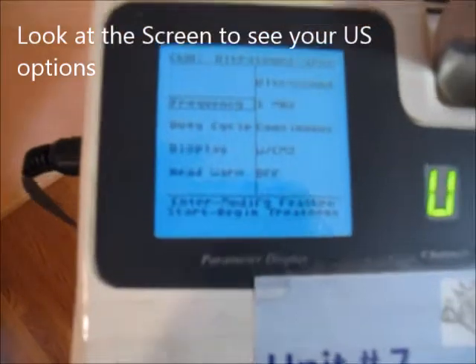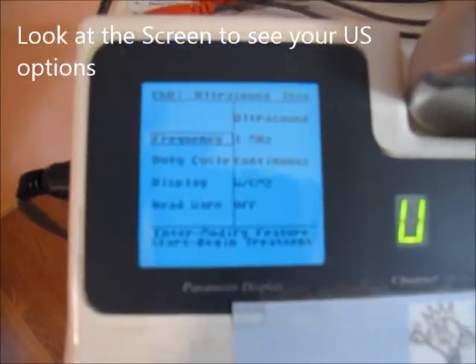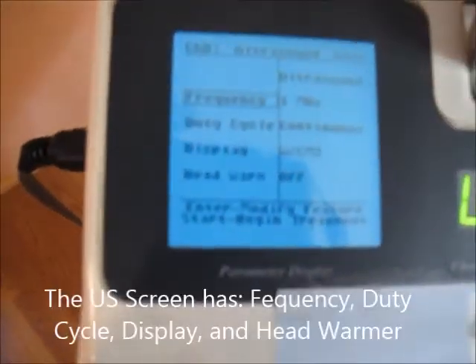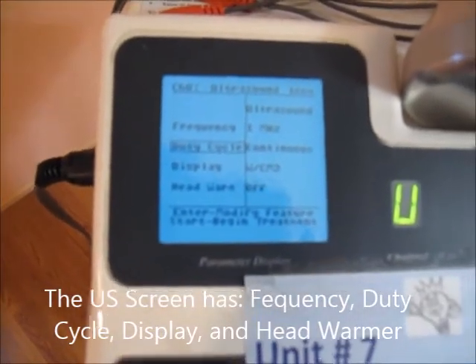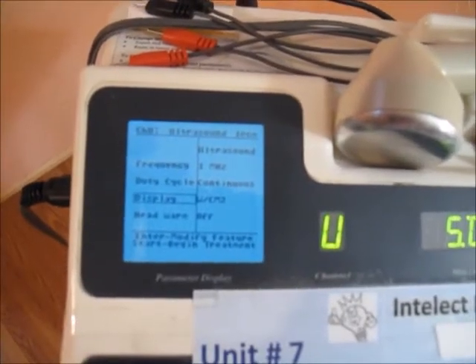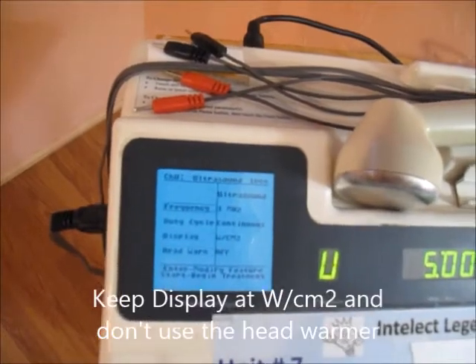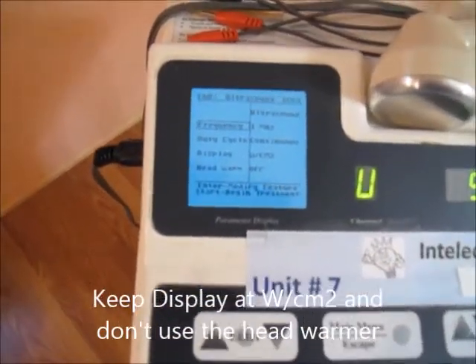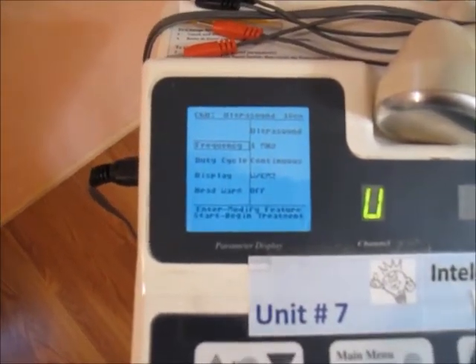Over here is a little screen asking us different questions. The questions they will ask are going to be frequency, and if I go down, you can see duty cycle, display, and head warmer. We're not going to use head warmer or display. Display will be watts per centimeter squared, and head warmer we never turn on because it actually tires your ultrasound head out early.